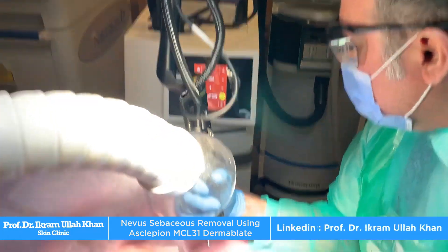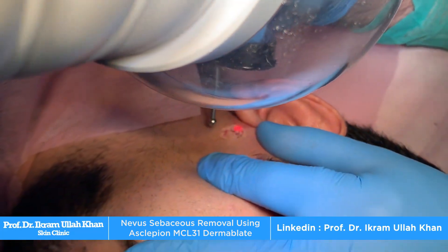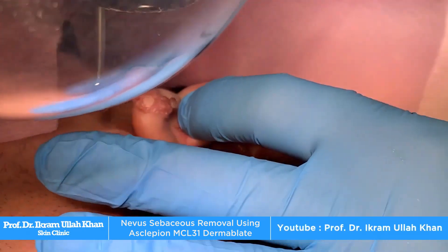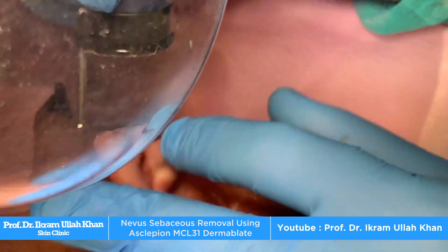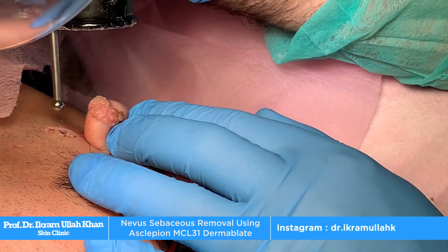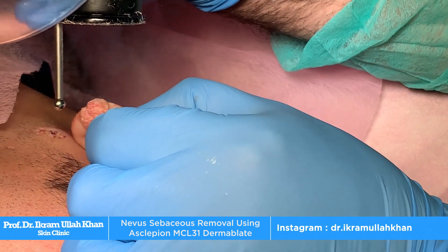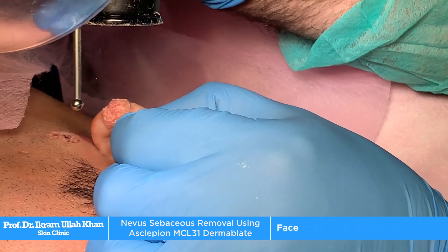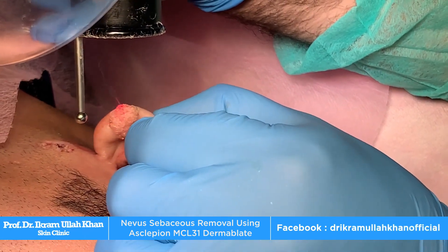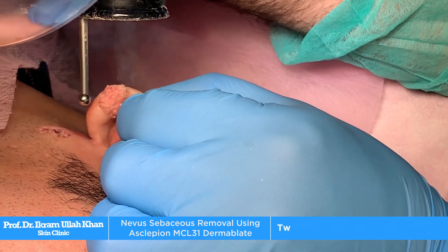It is called MCL31 Dermablate. Basically, we need to use the wavelength of this. We use a high pulse rate. It is good to use the pulse rate to reduce bleeding — I do not need the bleeding. I am treating the Nevus Sebaceous using this, the same as using blades. But when you do it with blades, the bleeding will be much more, so if it is bleeding, you will not see a thing.